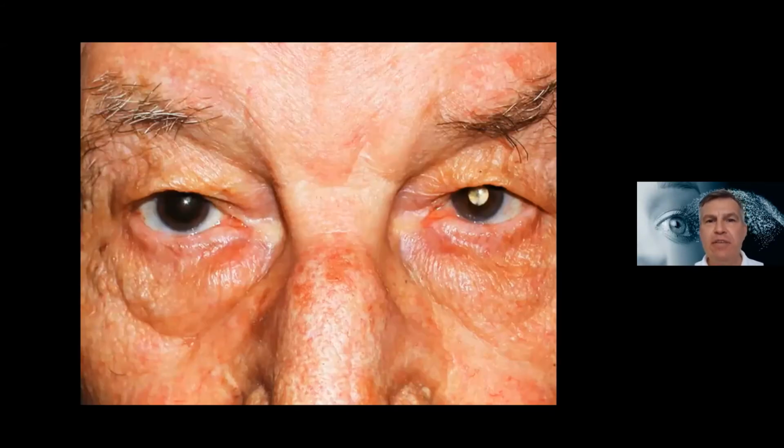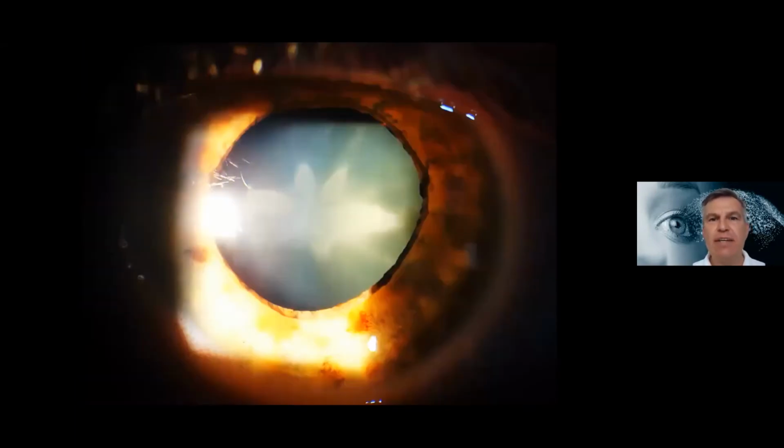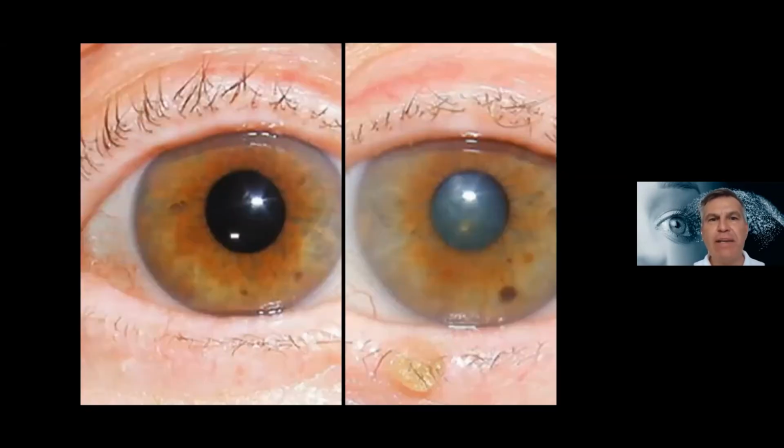And this patient, where is the problem? Of course, right eye is okay. I did a cataract surgery, but on the left eye, he has a white cataract. Also in animals, they may develop a cataract and you won't get really nice images. Like this cataract of a patient of mine. And look here, one eye, I did the surgery on the left side and the right eye has a cataract. So I will get much better images for the left eye than compared to the other eye. And this is very important when we start to talk about the imaging technologies.